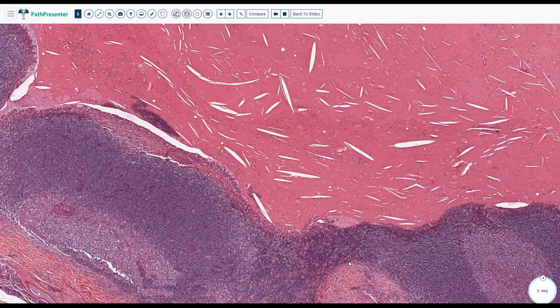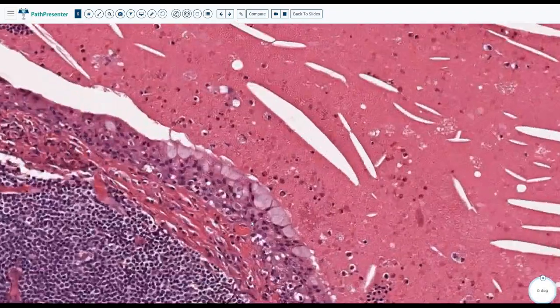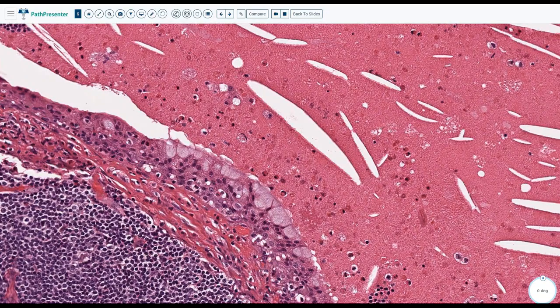Squamous metaplasia like we have here can be seen, so don't freak out. Maybe if there is a collection of these changes, you'll think, okay, it's better to take it out. If you have a lot of atypia or a lot of mucus changes, you want to rule out mucoepidermoid carcinoma. But overall, don't just jump on one cell and that's it. Take the whole thing together. And radiological features are also very helpful. Okay. All right, very good.